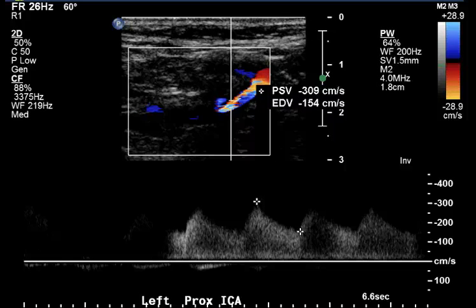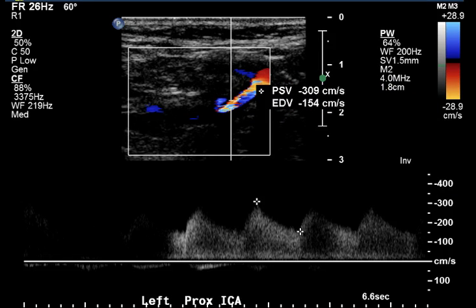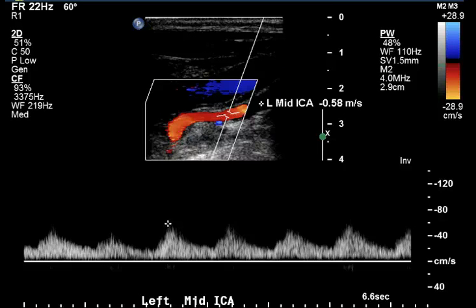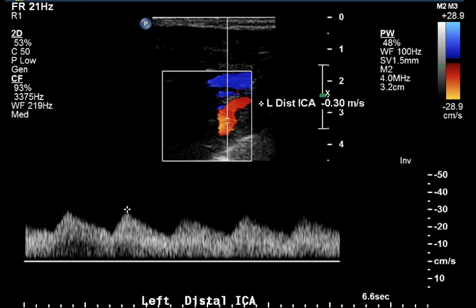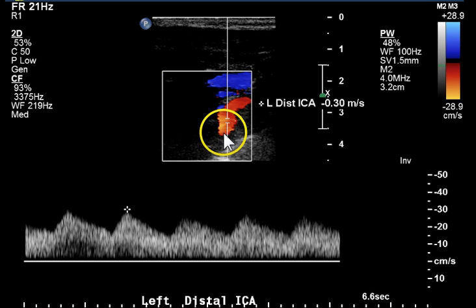Another area of high level stenosis shows an even higher velocity of 309 cm per second. Moving beyond the stenotic portion of the ICA into the mid-ICA, we see dampened flow, a rounded waveform, and a little zigzag or sawtooth waveform usually seen post-stenotically. Finally in the distal ICA, we are starting to get the appearance of a spectral window again, and there is no disease detected in this portion of the artery.